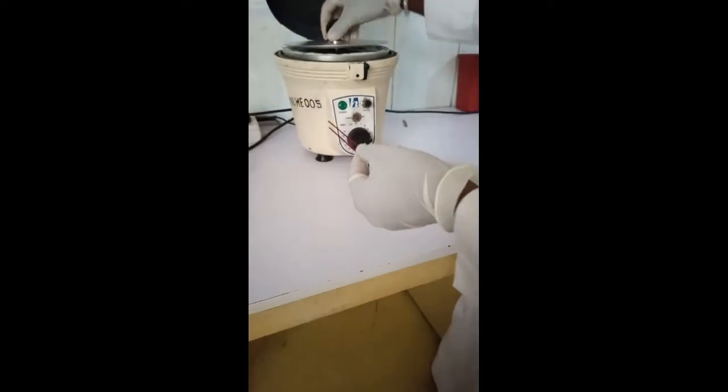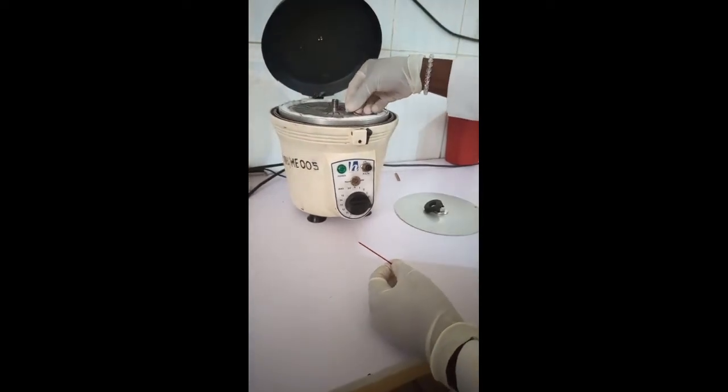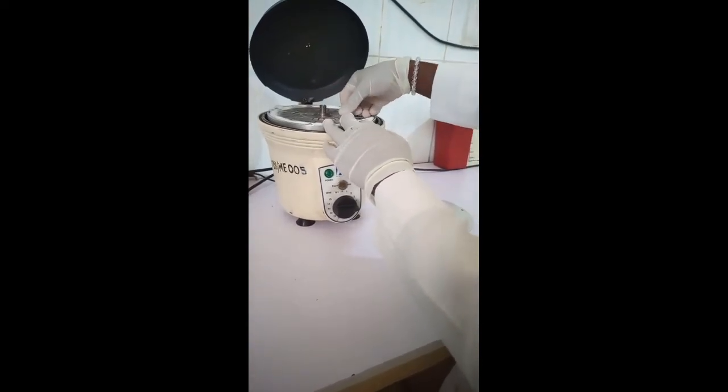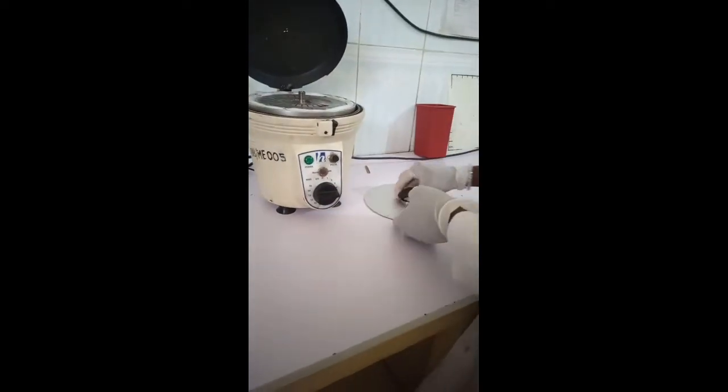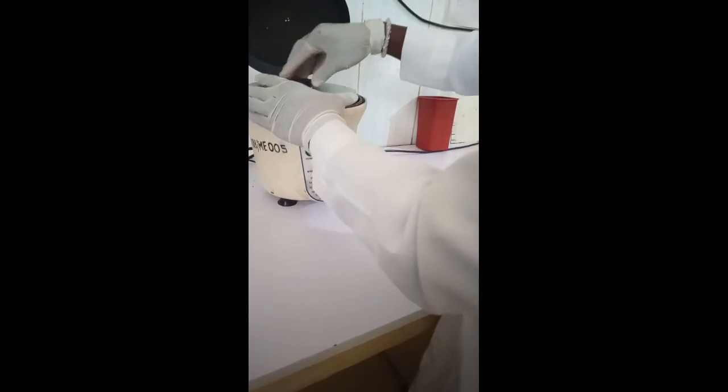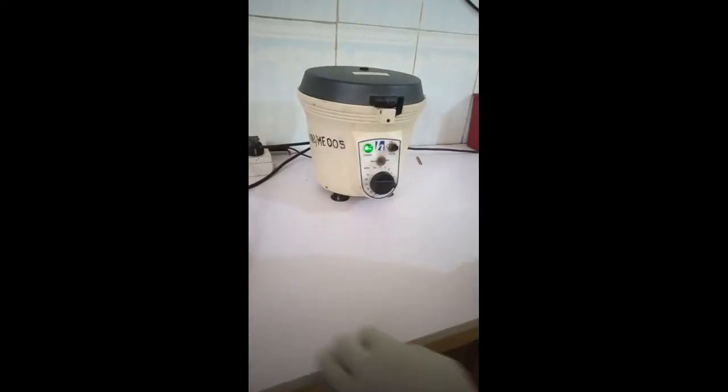So we proceed to the spinning stage. This is the micro-hematocrit centrifuge. We place the capillary tube in it with the sealed end facing you. And then you cover it. Remember both samples belong to one patient. This is because in case one breaks or you lose one, you will not have to repeat the procedure. You still have one to read. And then this is going to spin for five minutes.